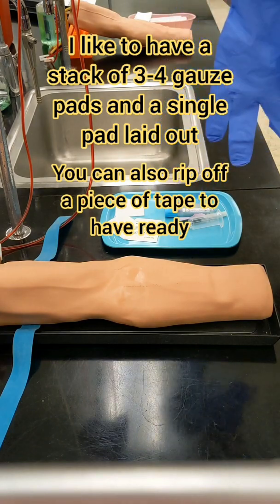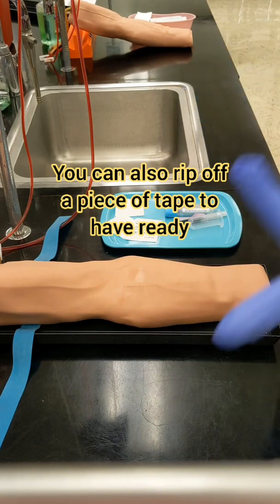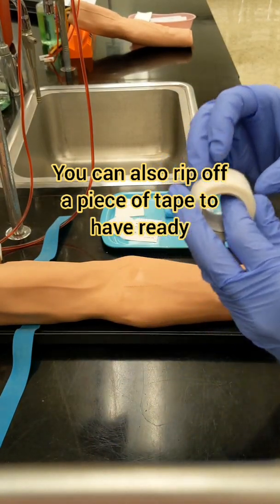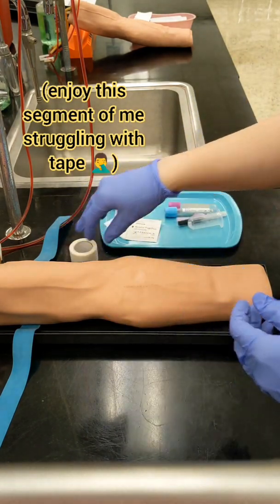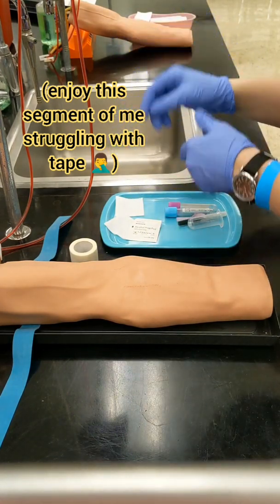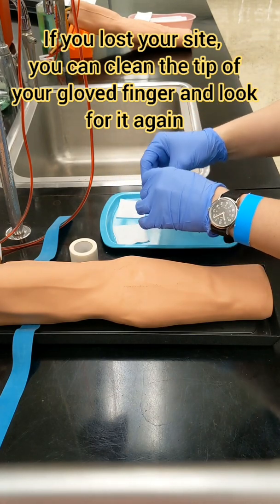I like to have my bandage materials ready before I start the procedure, but it's always a good idea to have your gauze ready before you start. My preferred setup is to have one piece of gauze and then two or three pieces stacked next to it, and then have my piece of tape or Coban already ripped and stuck to my tray, just waiting for me to grab it.